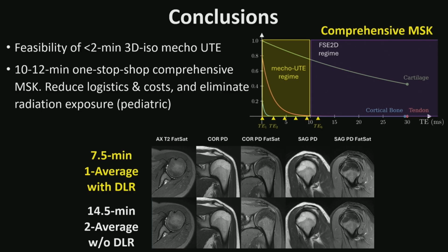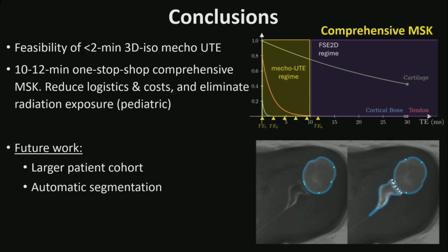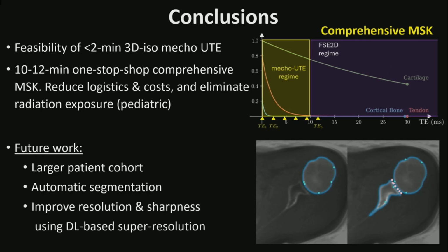CT assessments. Future work will evaluate the technique on a larger patient cohort and implement automatic segmentation, and the next step is to further improve resolution and sharpness using deep learning-based super resolution.